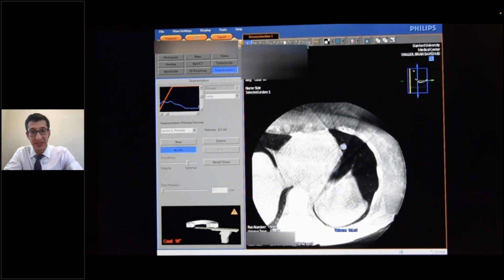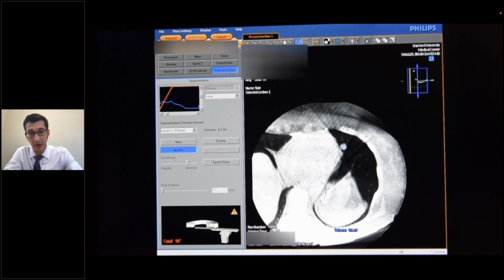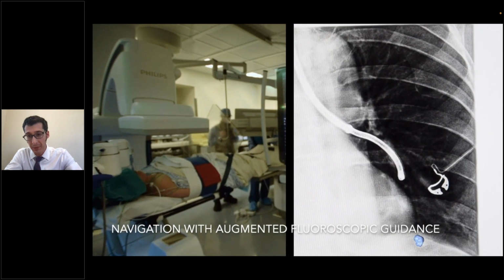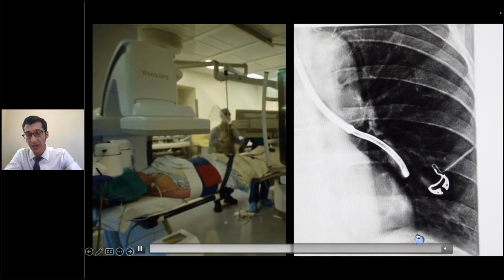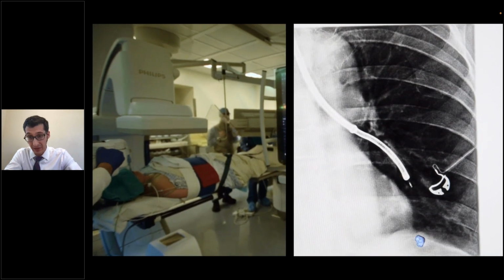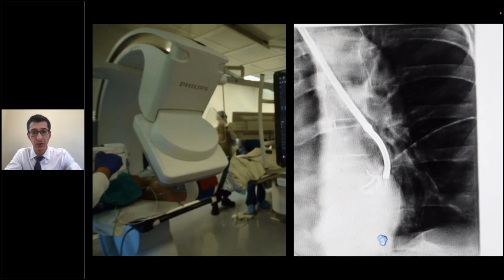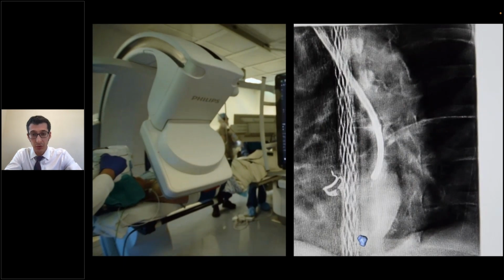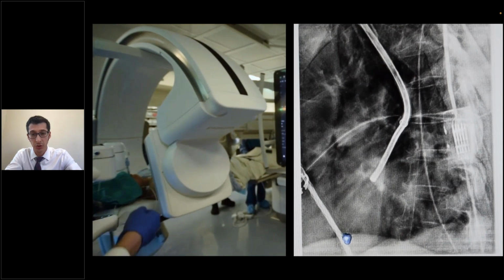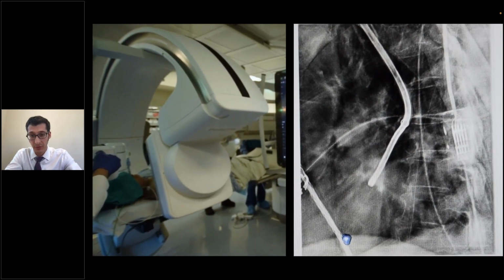And the purpose of this step is that then when you go into the room and step on your X-ray pedal, that image will be projected onto the screen. And this is a virtual representation of the nodule down here. So if you took the patient off the table, this virtual nodule would stay there. Or if you gave the patient a pneumothorax, the nodule wouldn't move. But as long as you maintain stability, you do good high pressure ventilatory settings, breath holds, that nodule should ideally correspond to the location of the nodule in real life.